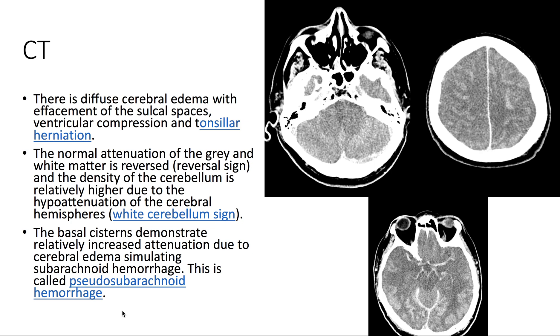On CT, we can appreciate effacement of the sulcal spaces secondary to diffuse cerebral edema. Also, the normal attenuation of the gray-white matter is reversed in areas, and this is the reversal sign.